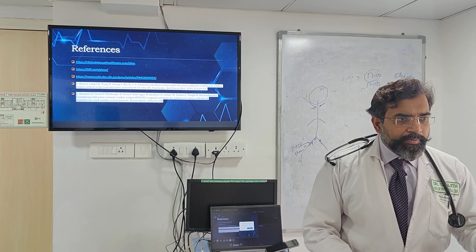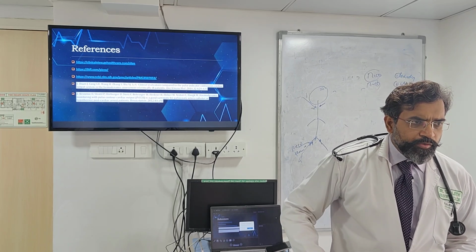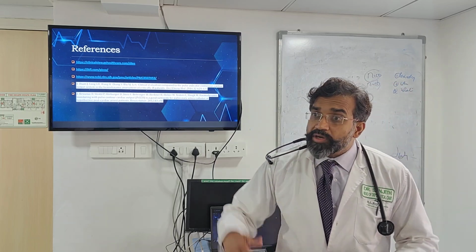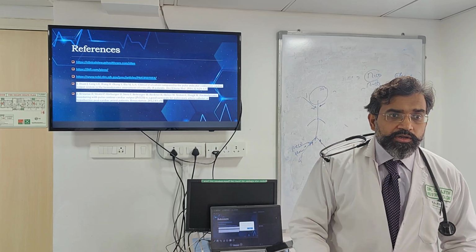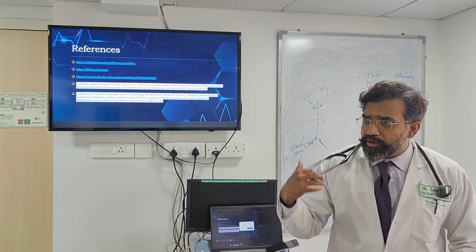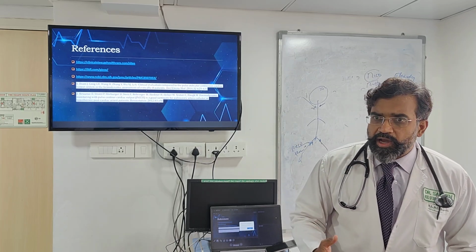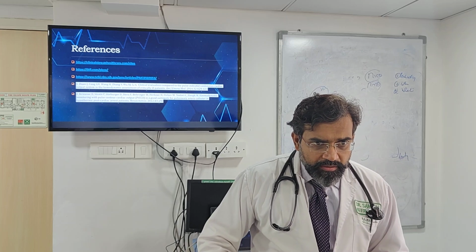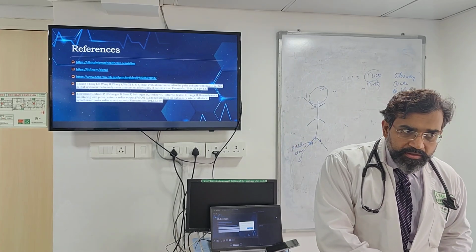Yes. However, what happens if you decide to put a femoral line? For example, we had a patient now. Many times it does happen that you can't put a jugular line. One patient we cannot lay supine to put a jugular line. It is very difficult. Patient niche kiya, patient starts breathing very horribly. So at that time you have a femoral line and a femoral Picco catheter.